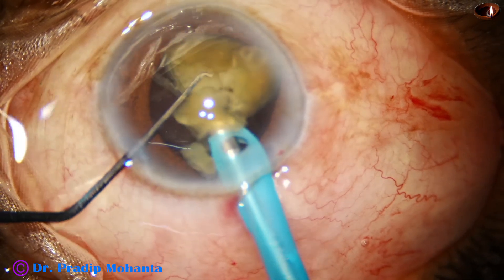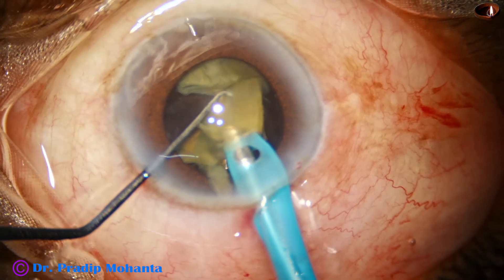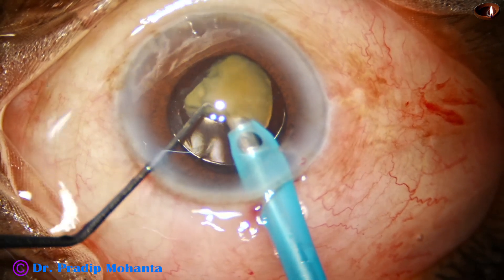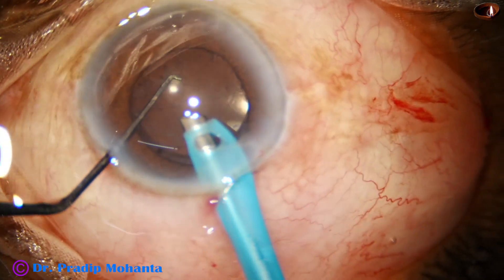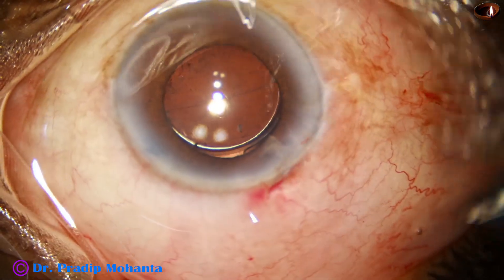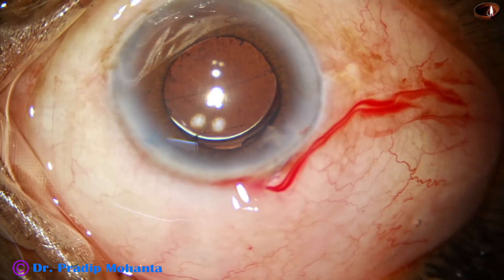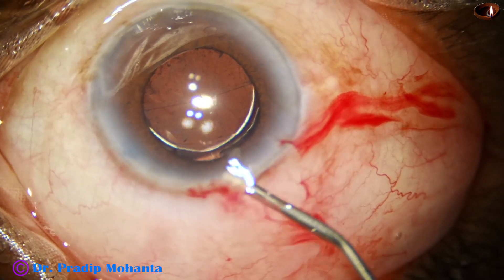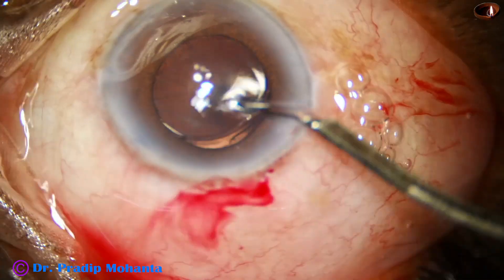The tip of the FACO needle — the titanium tip — should not touch the intraocular lens and it should be far away from the corneal endothelium. We have to keep it at dead center where the corneal endothelium is much above because the cornea is dome-shaped. Nicely emulsified. There is a small nuclear fragment at the wound; it will come out by visco expression. It has come out and now we just have to remove the viscoelastic.